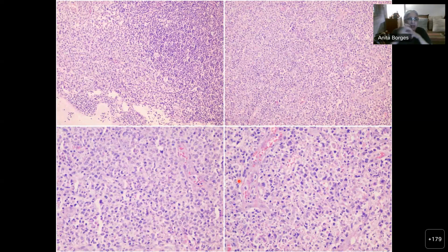When you look at the pale areas, they are pale because the cells have a lot of cytoplasm, so they're very unlikely to be lymphocytes. Of course, there are lymphocytes running around within this. You also see some tingible body macrophages over here, so you can see a reaction center. Around that reaction center, you can't see a mantle so well. You see these pale cells. Now, what can be pale cells except histiocytes? They don't look like lymphocytes, so they have to be histiocytes. And if you look carefully, you begin to see apoptotic bodies. So there's no prize for guessing this.